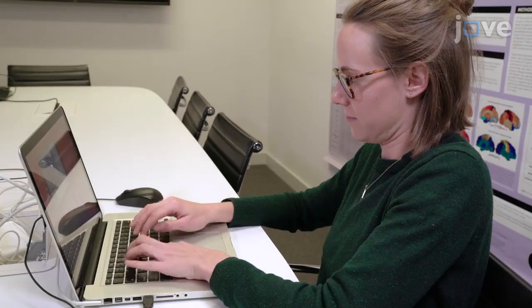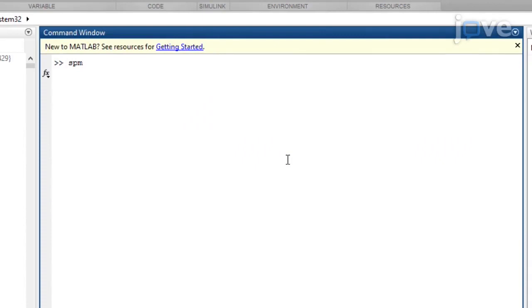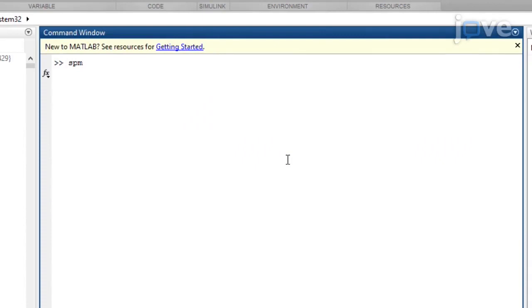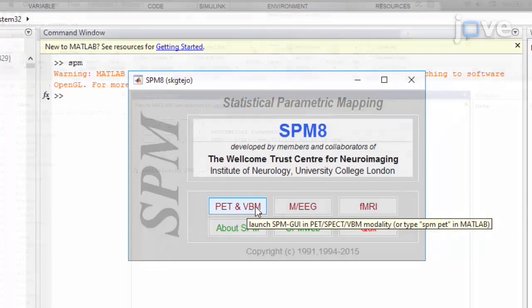To begin, open SPM software by opening a MATLAB command window and typing SPM into the command line. Then, to perform unified segmentation, select PET and VBM to open the structural MRI toolbox.